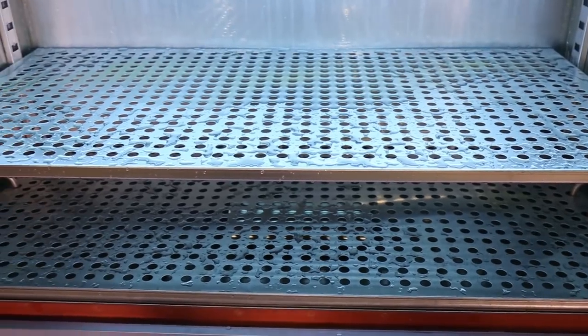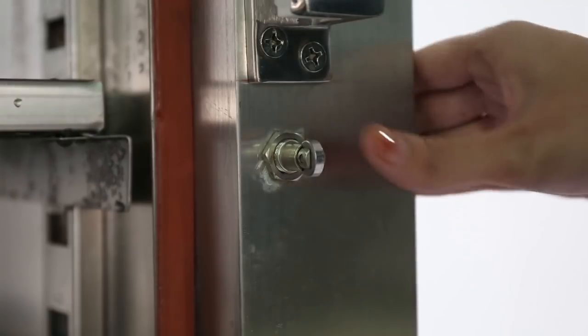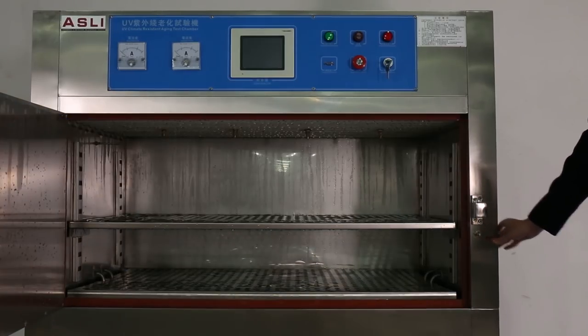Our chamber has good safety and protection functions. When someone suddenly opens the chamber door, the machine automatically shuts off. When the door is closed, the chamber starts again automatically from where it left off.